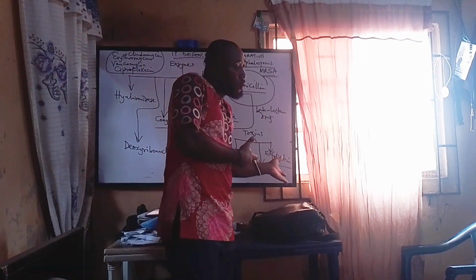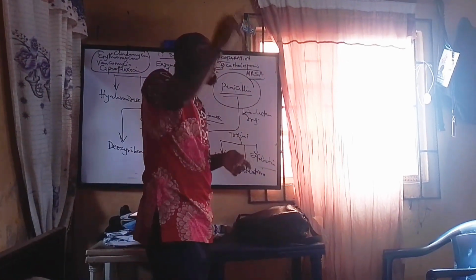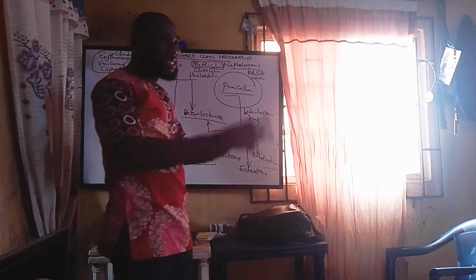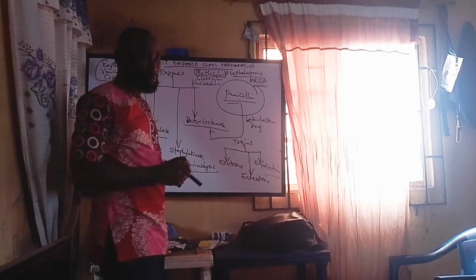That person might be sensitive to maybe chloramphenicol. It doesn't mean that chloramphenicol can cure for everybody. No, no. Another person can find that chloramphenicol will not work. So that's why it is still best to do a sensitivity test.